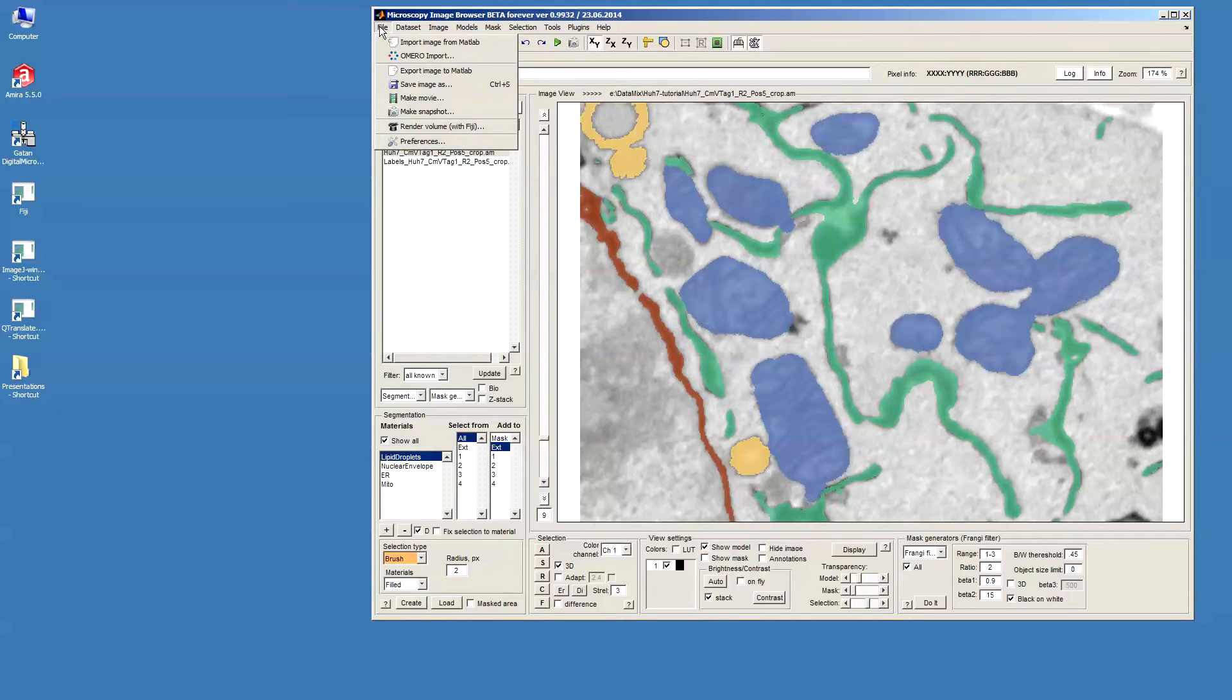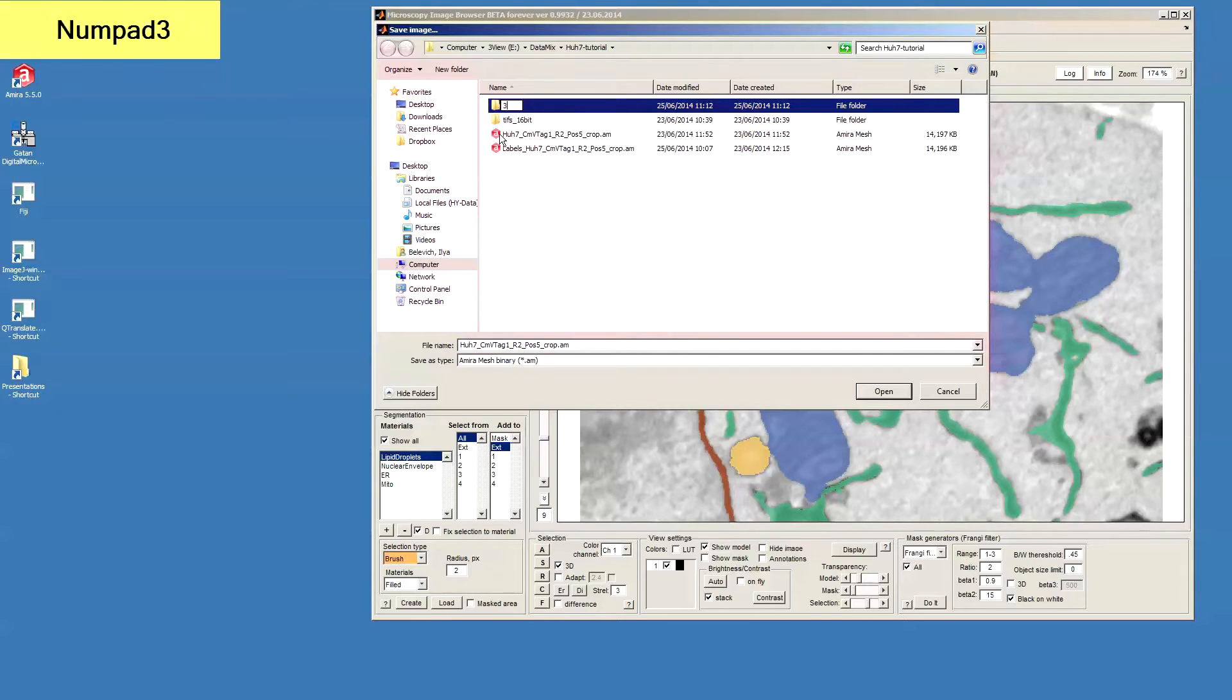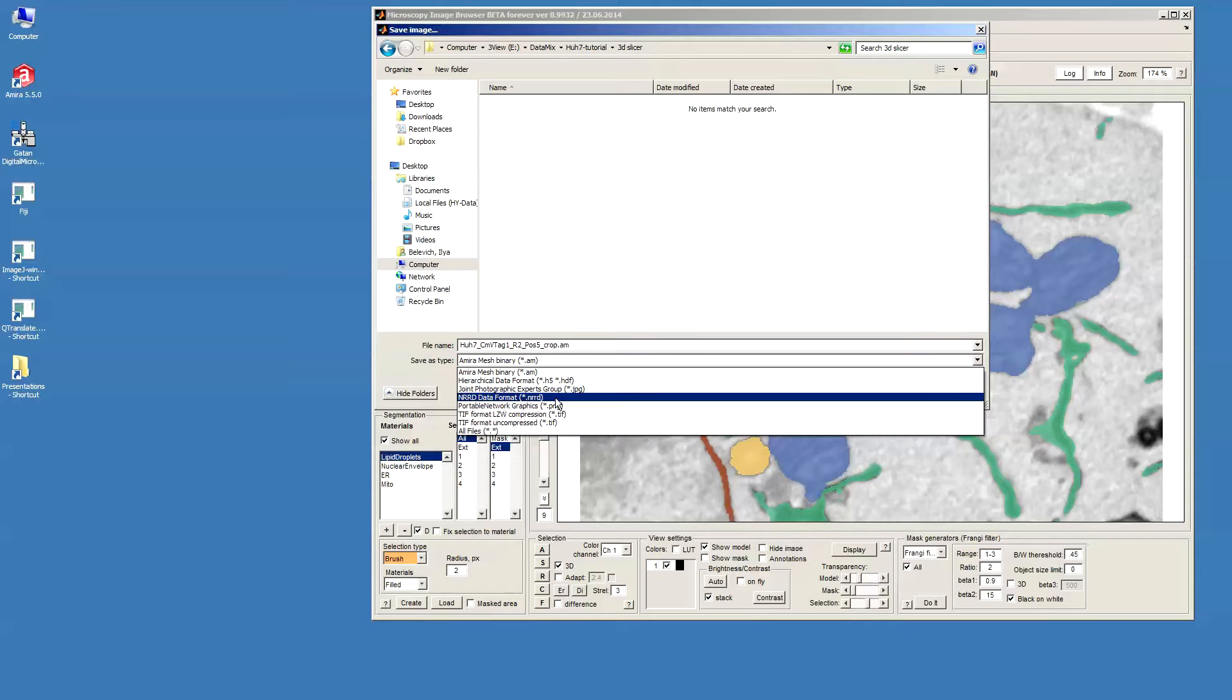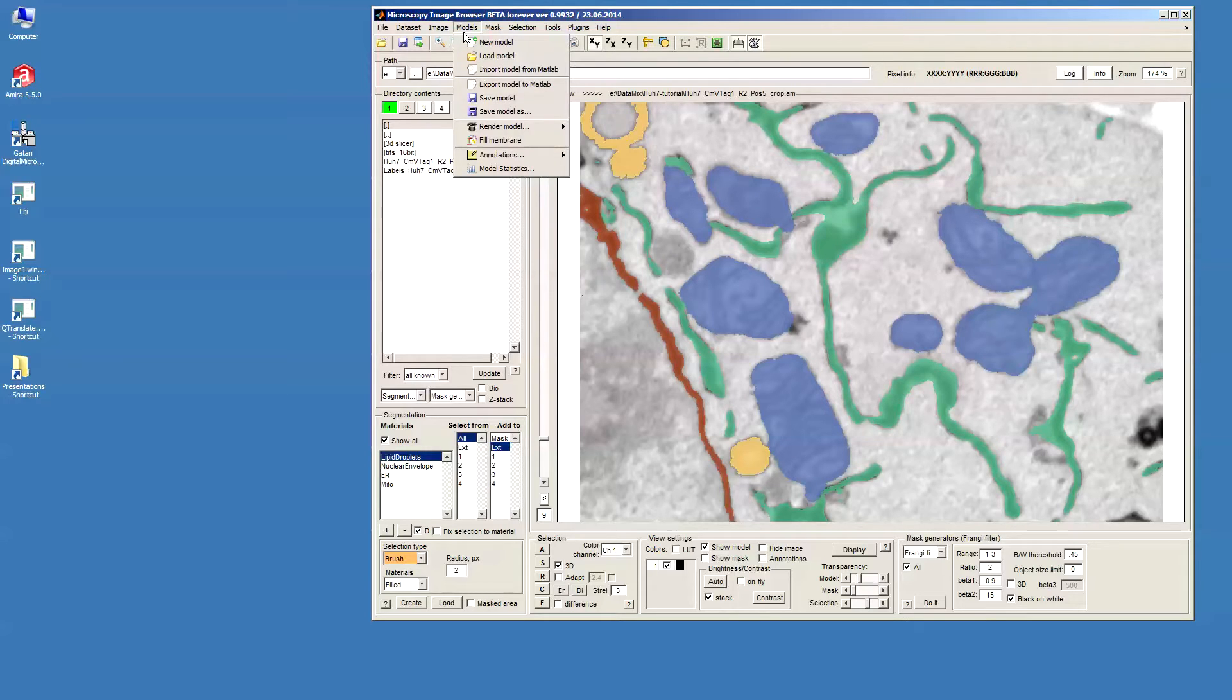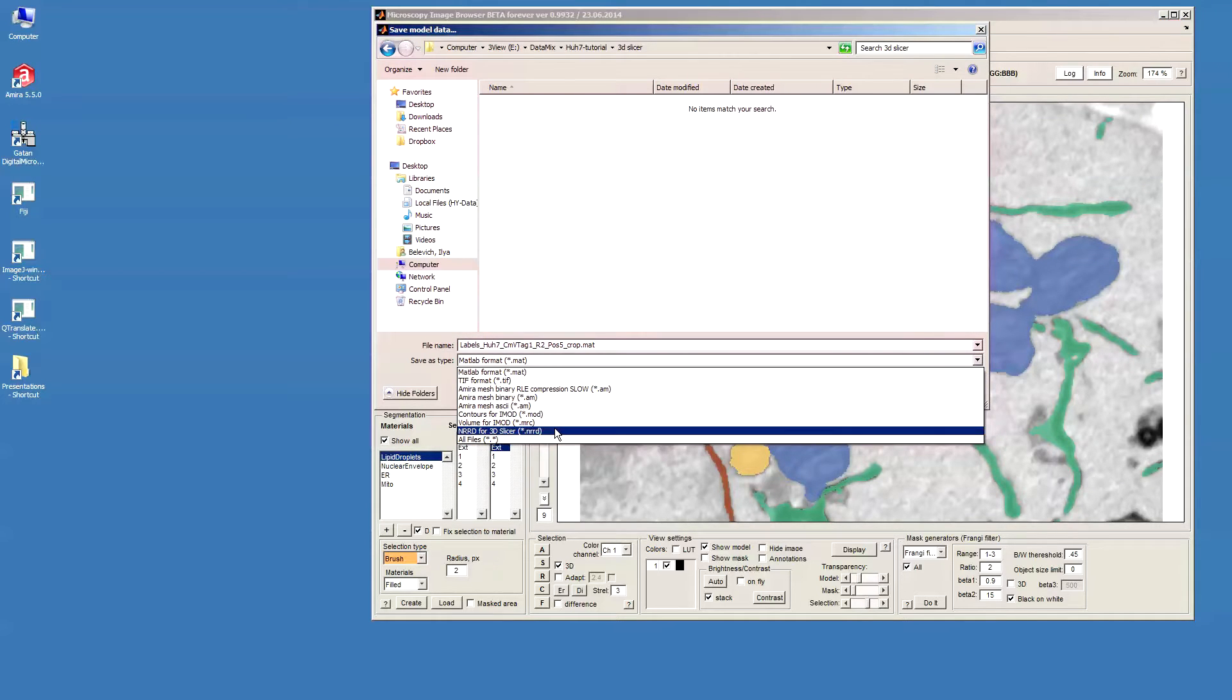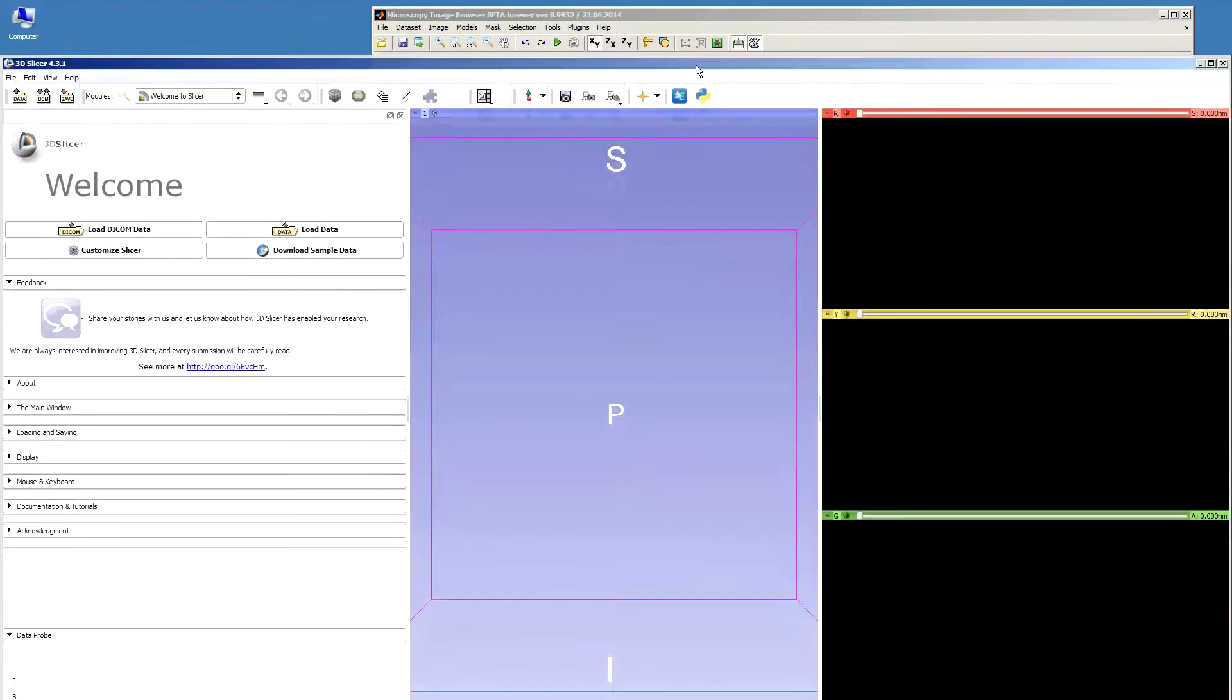In the easiest way, we need to save the image in a format which is directly compatible with 3D Slicer. So I'll make a directory and save the file in the NRRD format. Then I'll do the same for the model, and use the same NRRD format. So the data is stored, then I can open 3D Slicer.